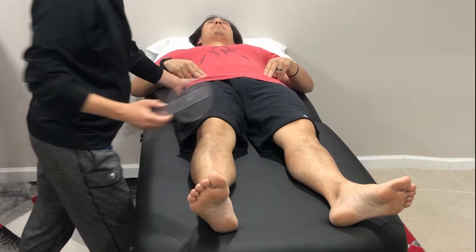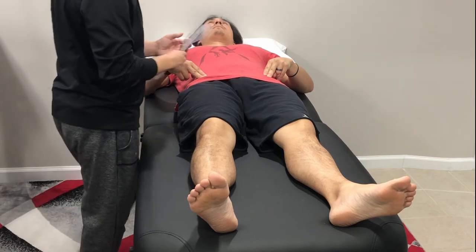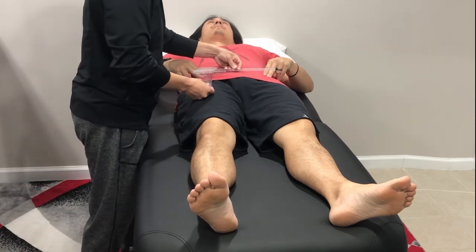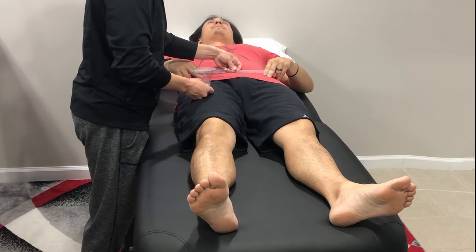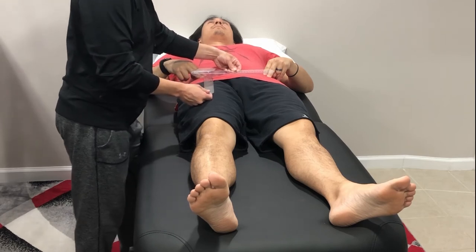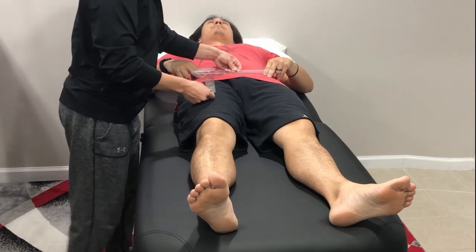To check active range of motion with a goniometer, I'm going to line the fulcrum up over the ASIS. Place one arm, the stabilizing arm, so it's lined up between the two ASISs, and lining the other arm up with the center of the femur. And go ahead and have you slide that leg out.